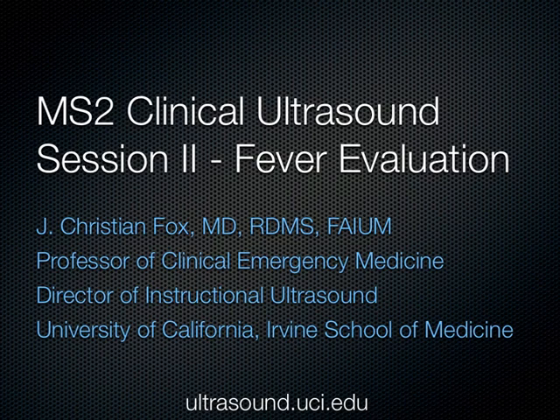This time we're going to be talking about fever evaluation, and we're trying to coordinate the ultrasound curriculum as close as we can with your other curriculum. Since right now you guys are focused on fevers and infections, I thought I would go through the approach to a patient who has a fever using ultrasound.